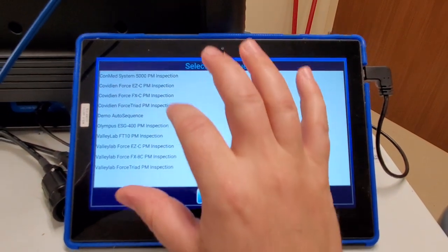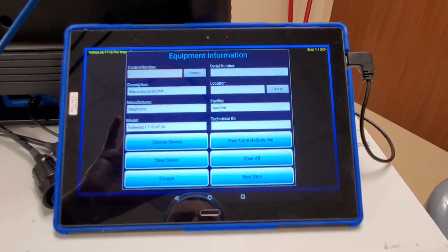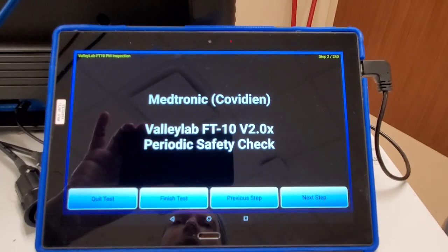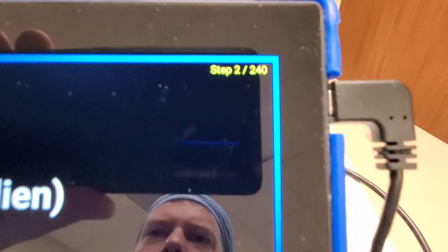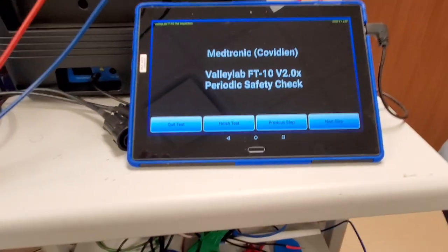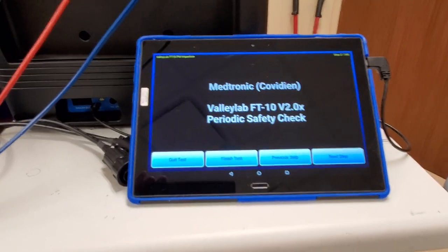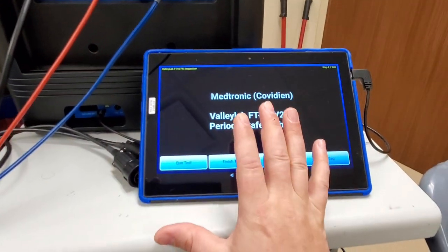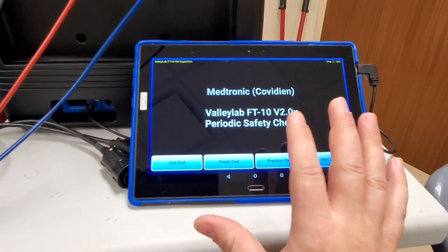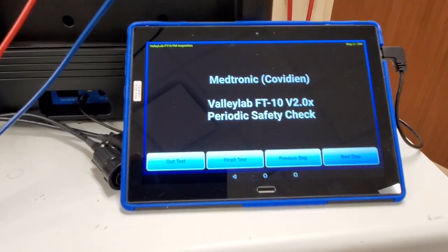For example, let's do the FT10. Yes, yes, yes - choose device. This has good documentation, I'll give them that. But you ready for the downside? I'm on slide two of 240. 240 slides to do a PM on just a regular FT10. Who's going to do that? You're going to get maybe two or three units done before lunchtime. This would be perfect for a Biomed 1 because I can send him through the auto sequence, but you've still got to go through 240 slides. That's absolutely ridiculous.